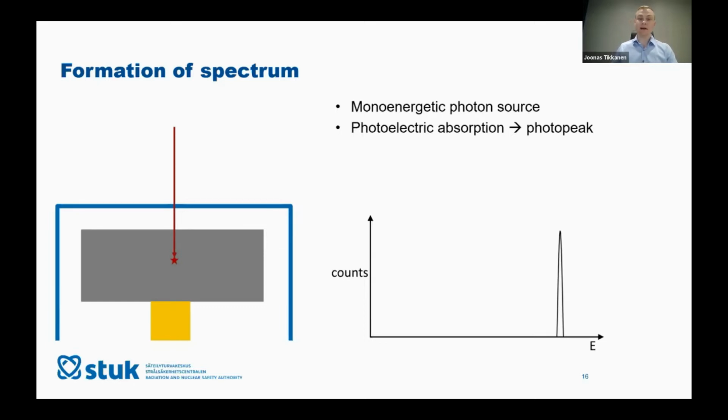It means that on the x-axis, at the energy of the incoming photon, we get multiple counts in this so-called bin, which forms when we measure long enough. We measure a peak in the spectrum through these events. In an ideal world, all the counts would be in a single bin of the spectrum, but in reality it has this slightly Gaussian shape.